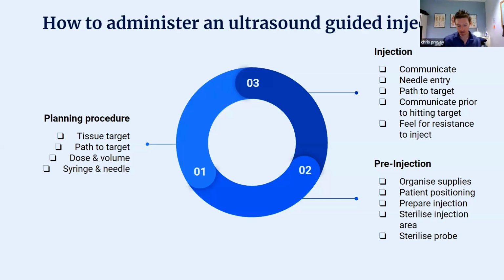So it's a bit of experience, saying, well, I want to use the thinnest needle I can, but I want to be able to get there efficiently. For hands and so on, you can use these tiny ones. For example, I'll show you this. So for hands, you can use these tiny needles there. Generally they'll be more out of plane things.